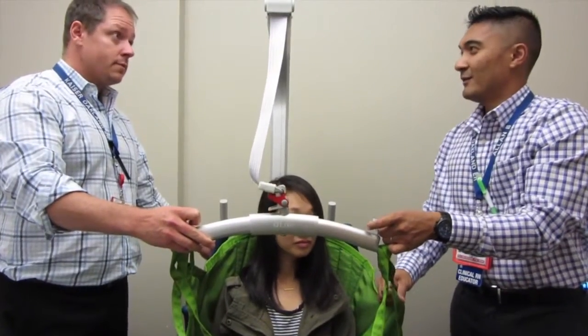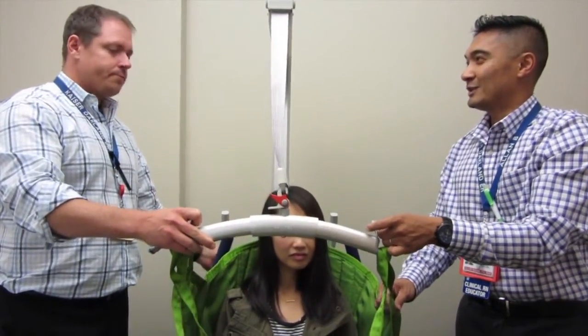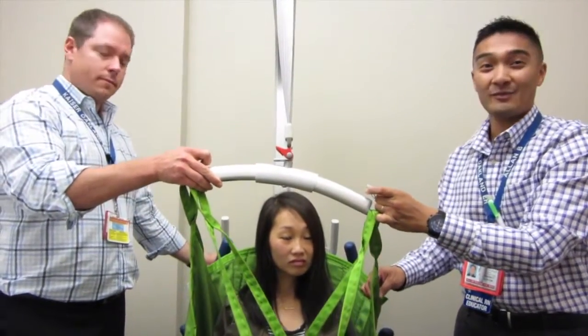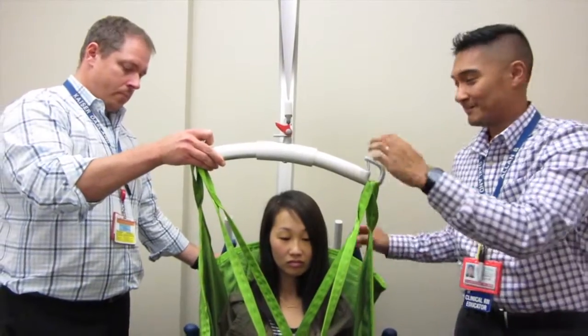A couple things, I don't know if you guys have it over here. We have the disposable ones at Richmond. So over at Richmond, one-time use, probably might get that as well. One-time use for the Golvo slings.